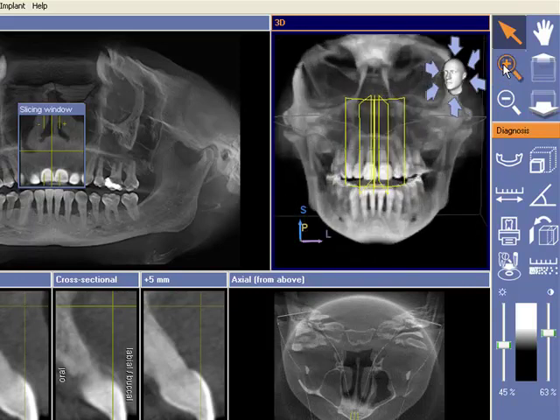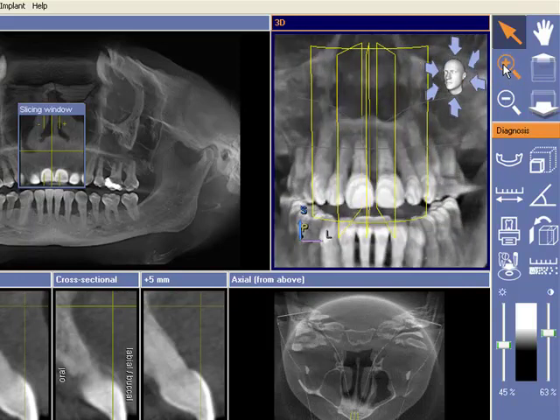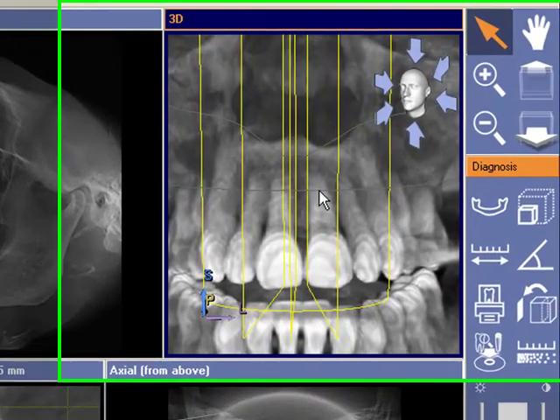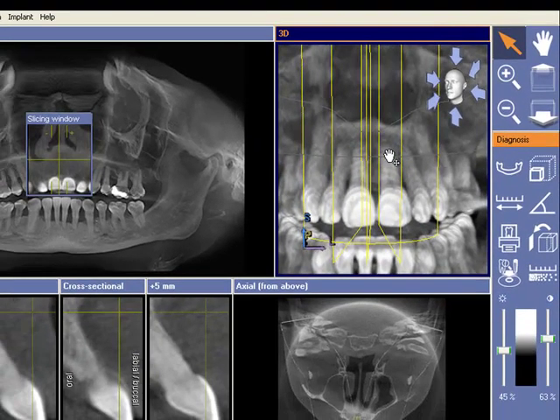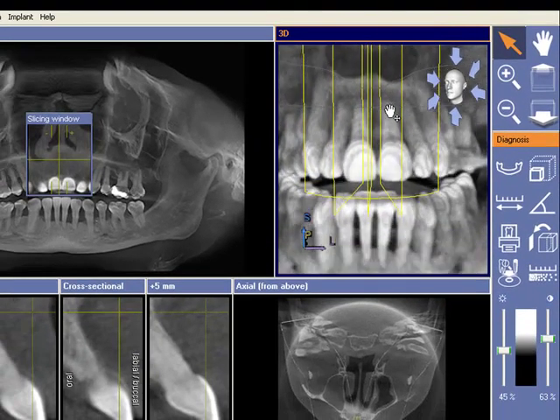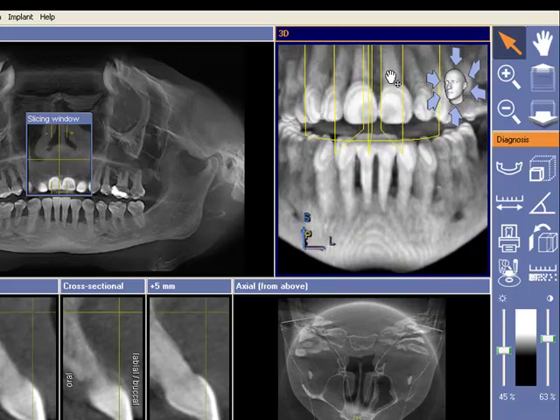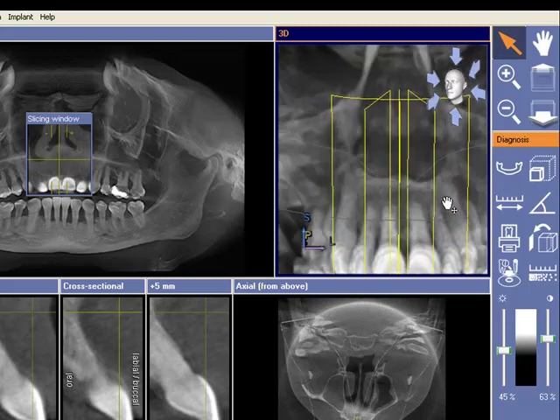Also, if you're zooming in too far and you've missed your area of interest, you can left mouse click and you'll see the hand come up. That's your icon to let you know you can move this around the screen, so you can move it up, down, or either side to get to the area that you're after.